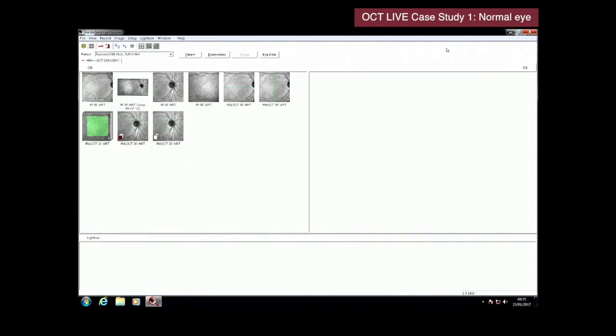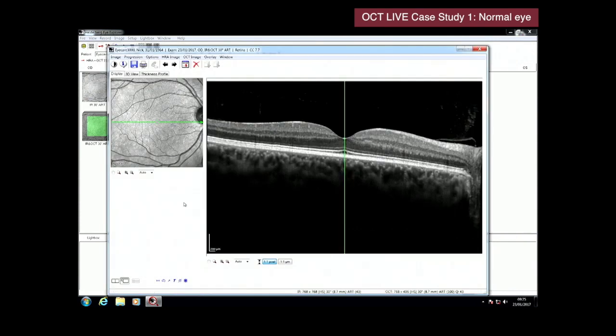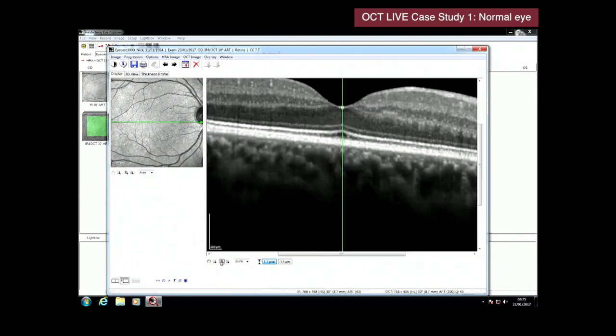Okay, so if we can look at the OCT scan, go for the horizontal line, please. Okay, when we're looking at an OCT scan, what we're looking for is this sort of shallow roller coaster Big Dipper profile at the fovea. Okay, this is a normal foveal profile. The outer retina has a gentle concurvature to it, generally speaking, and what we're looking for is this clear laminar structure to the retina. Phil, could we just zoom in a little bit on the OCT cross-section, please?